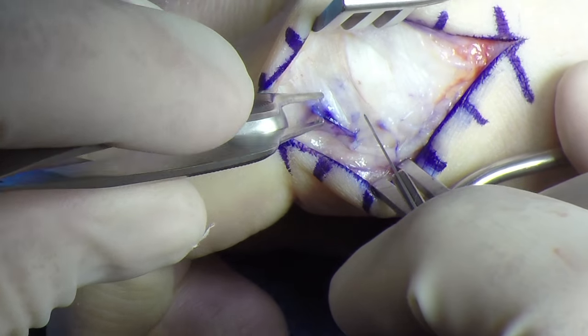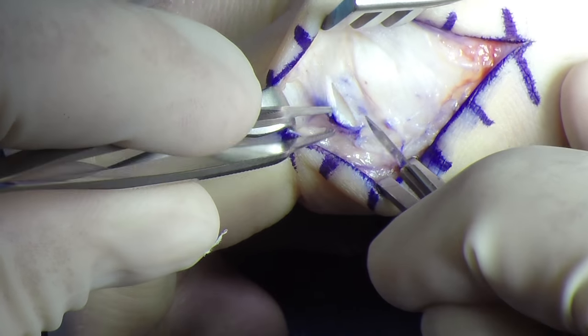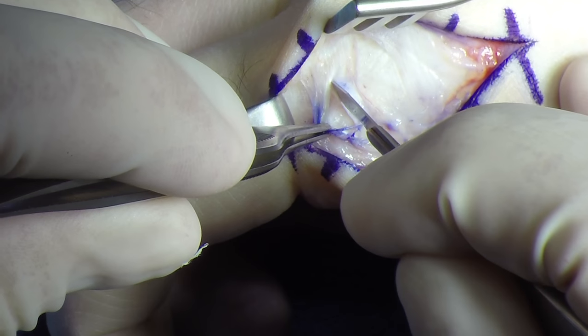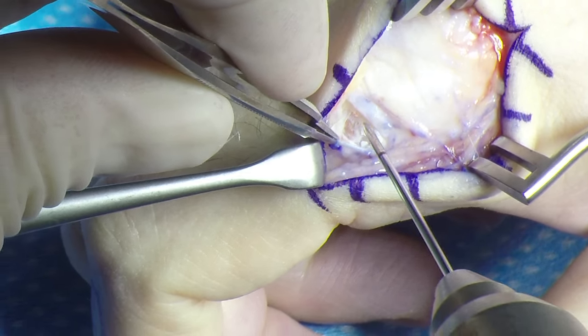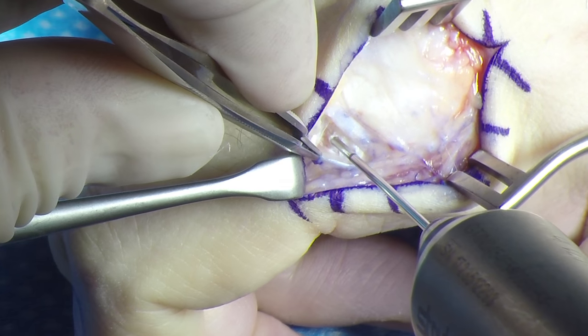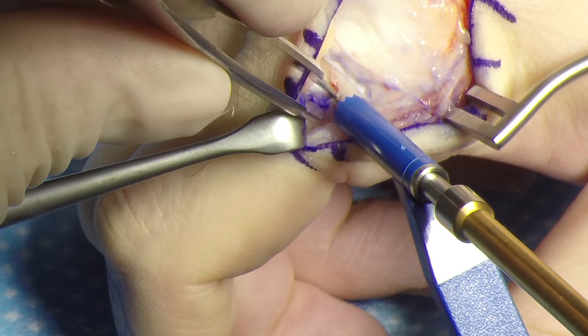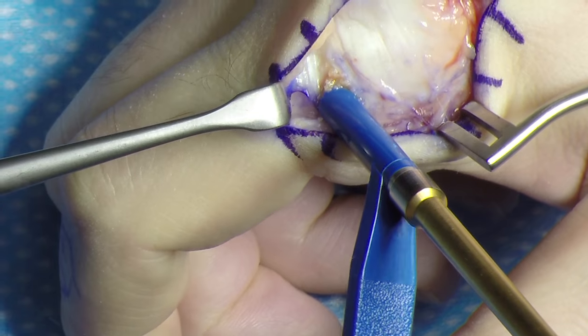An incision is made in the sagittal bands in line with the fibers. A guide pin is then placed at the insertion of the collateral ligament, sitting on the volar aspect of the proximal phalanx. A 3.5 millimeter drill is then used over the guide pin.